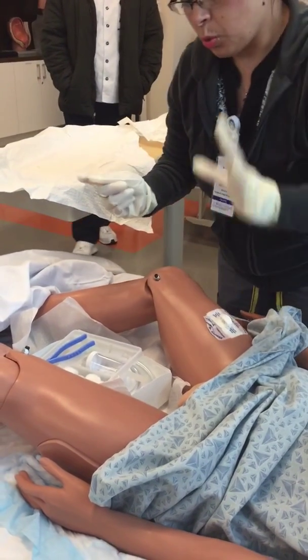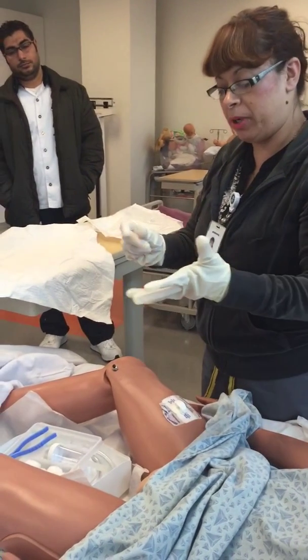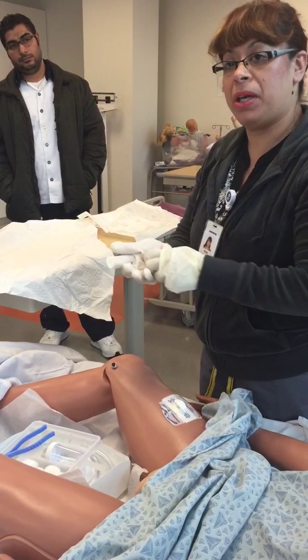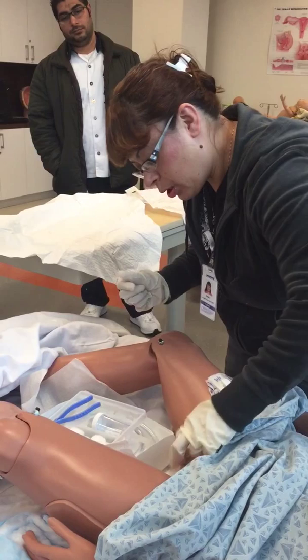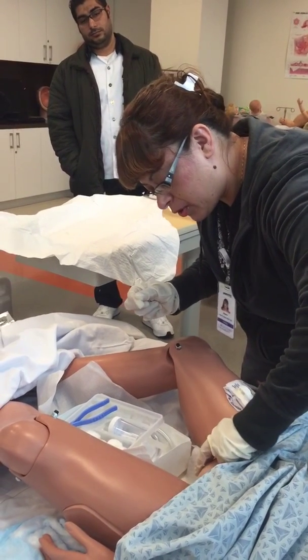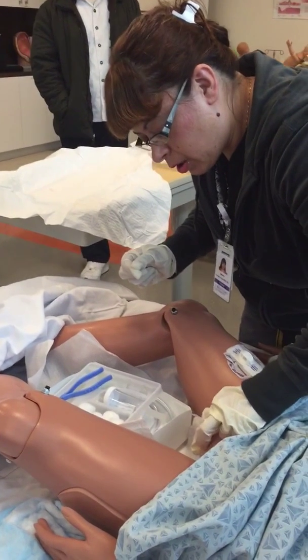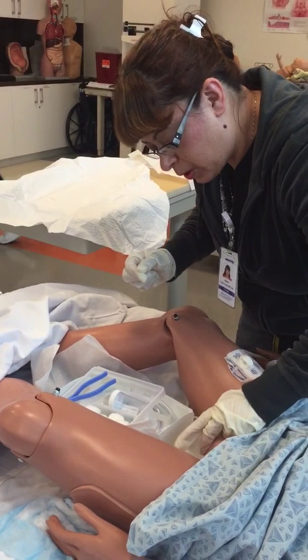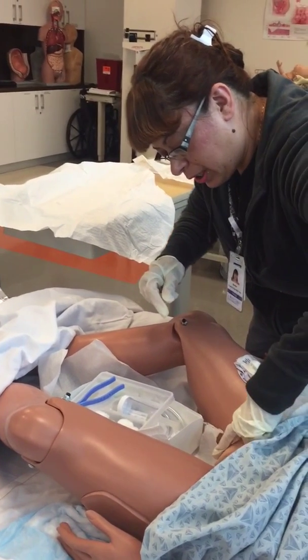Once you have that, use your non-dominant hand to open up the labia. You want to tell the patient that you're going to touch them. So I'm going to open up, and since it is a mannequin, it is very hard with big old gigantic gloves too. It's hard to work with gloves that don't fit you. All right, there you go.